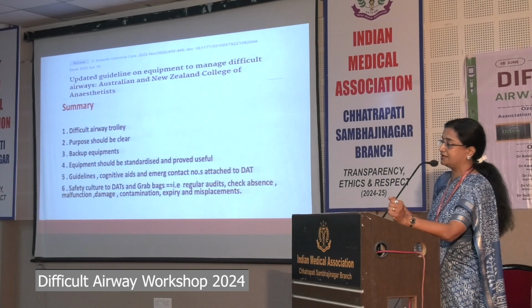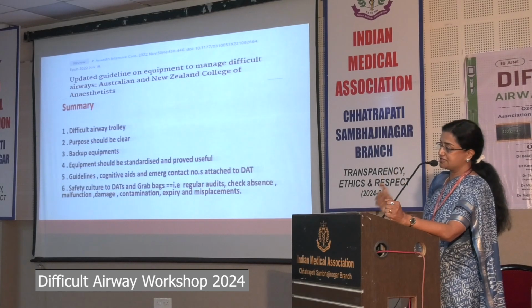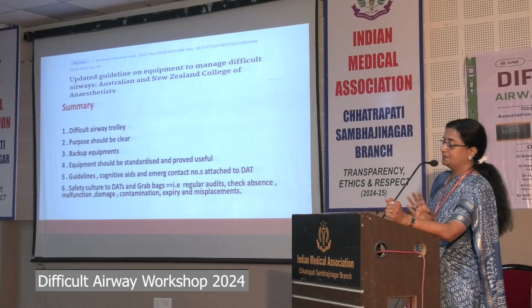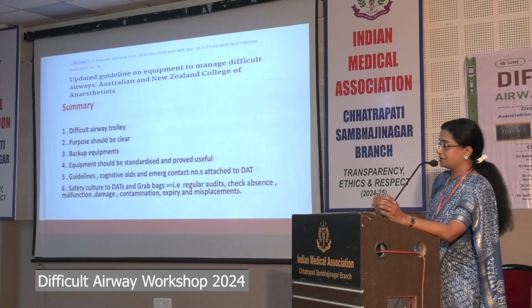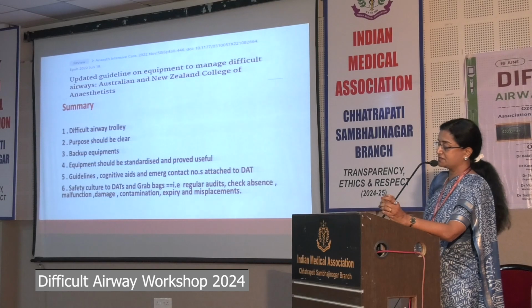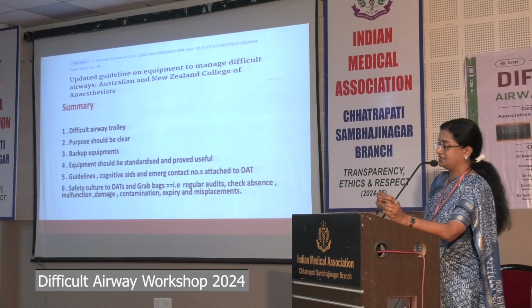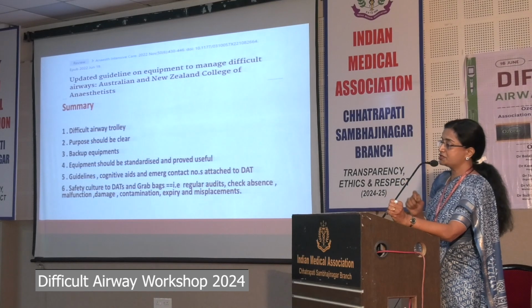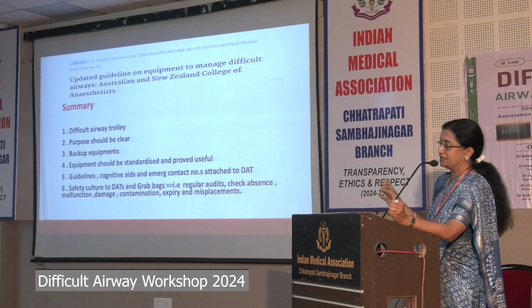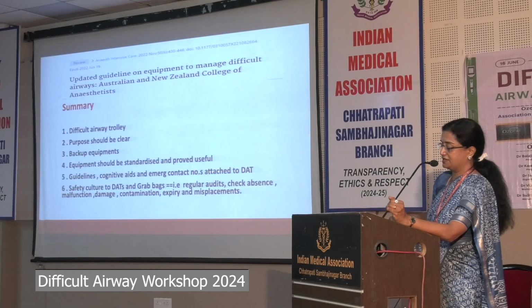It should be easily recognizable, readily accessible, with clean, readable labels, and facilitate efficient use. The purpose should be clear. You cannot keep buying any equipment, as the management will not allow it. So the equipment should fit the purpose, with evidence supporting it before the purchase is made and its clinical use. Backup equipment should always be ready. Your ventilator can conk off, so your ambu bag should be ready. Always keep a backup if the first line equipment fails.